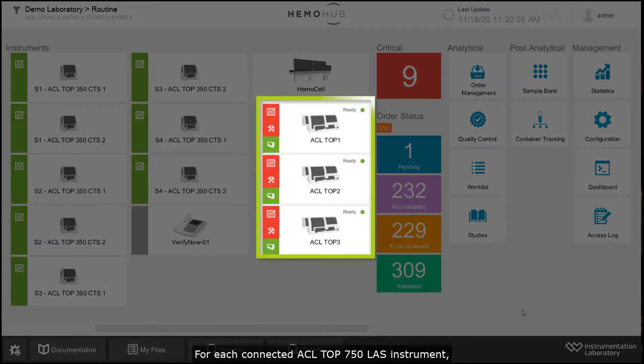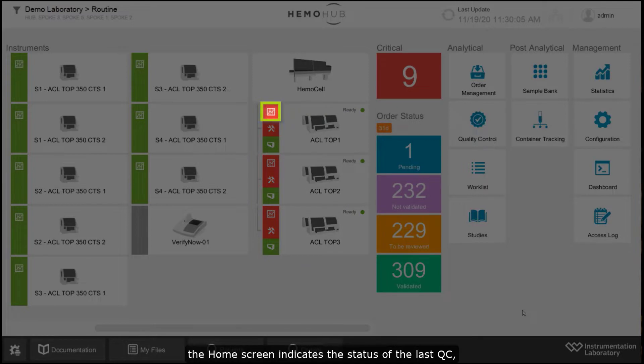For each connected ACL Top 750 LAS instrument, the home screen indicates the status of the last QC, maintenance, and test feasibility.